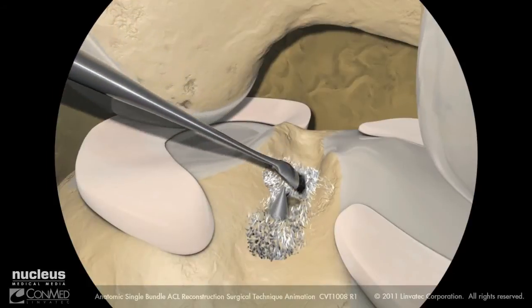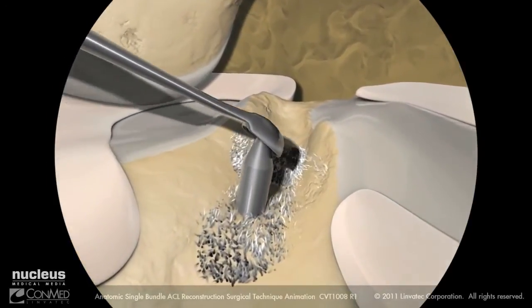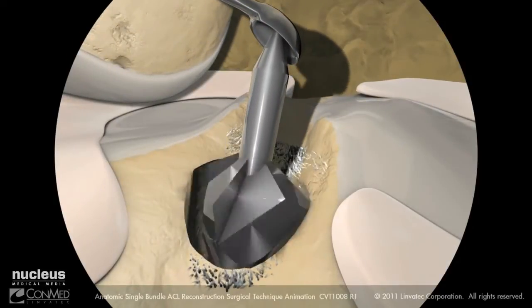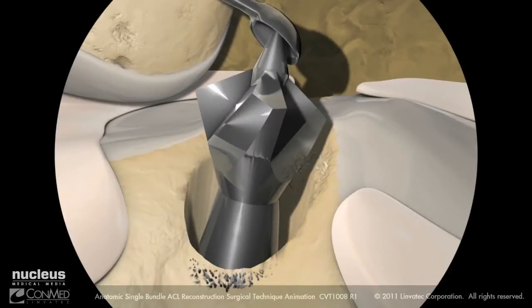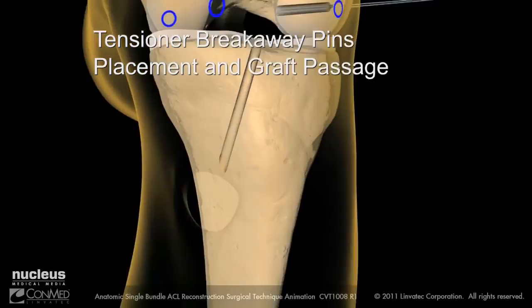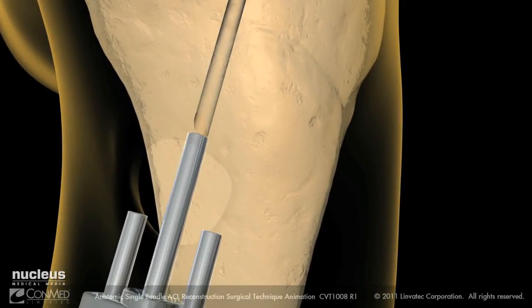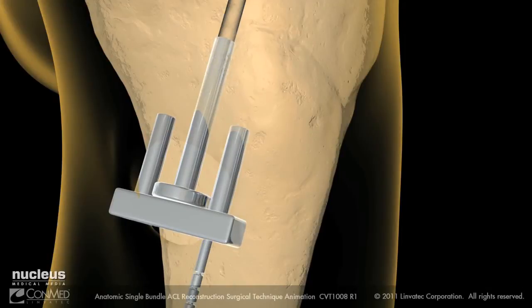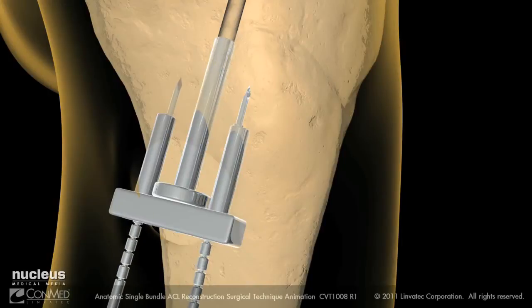A curet can be placed over the point of the guide pin to protect against inadvertent advancement when drilling. Be sure to use the appropriate size badger or sentinel drill bit to drill the tibial tunnel. Using the appropriate size SE graft tensioner drill guide, place the guide in the tibial tunnel and position two breakaway pins, then remove the guide.